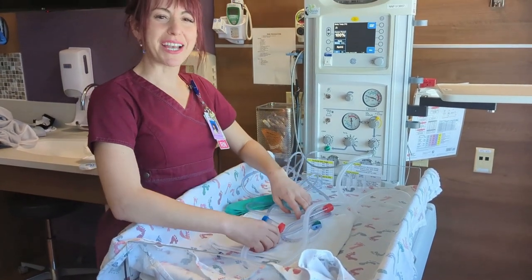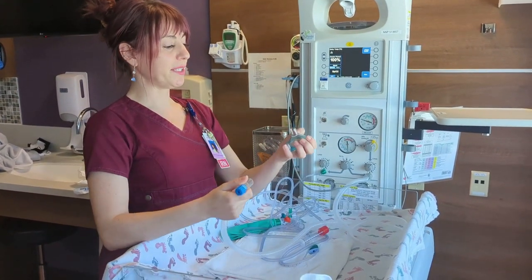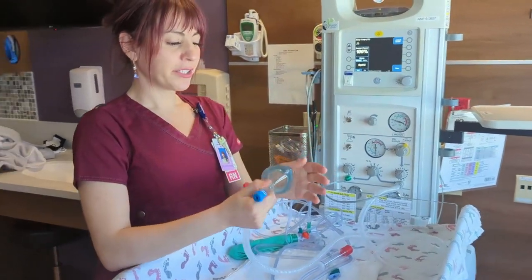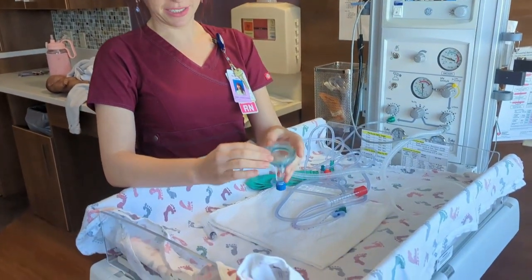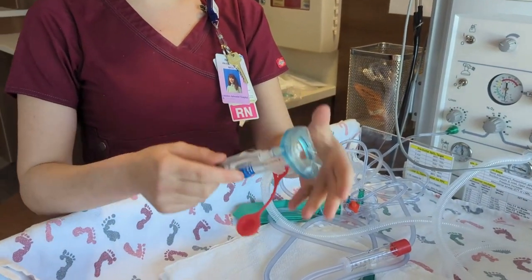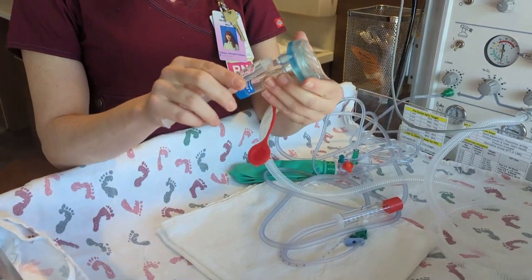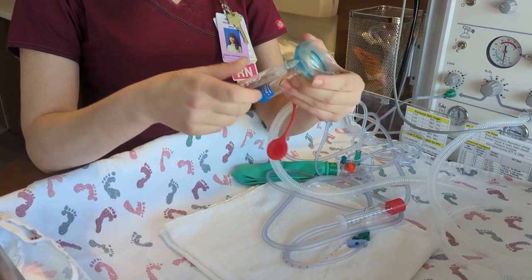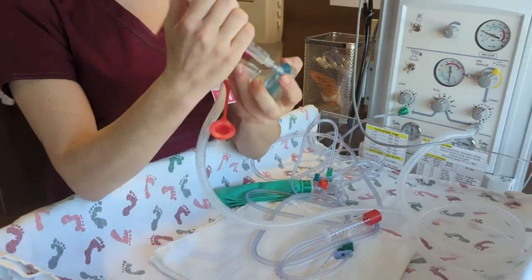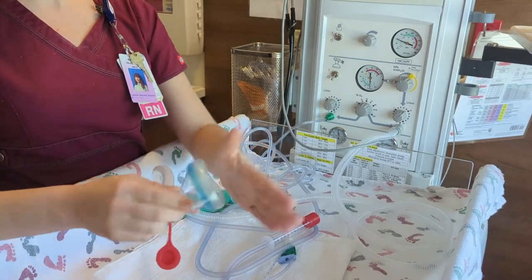Now let's find an appropriately sized mask for the baby we're expecting. We're expecting a term baby, so I'm going to use this newborn mask, but it seems a little deflated. We're always going to check our mask to make sure it fits well. If it's really deflated or over-inflated, you can attach your syringe to the top here and add some air.